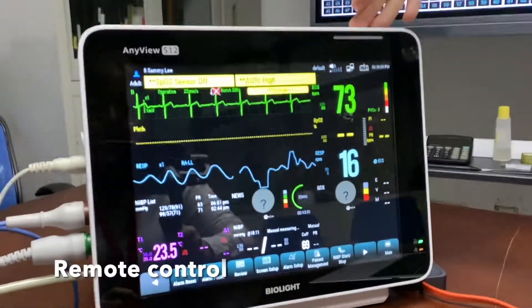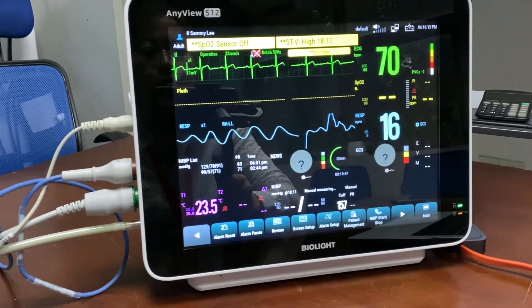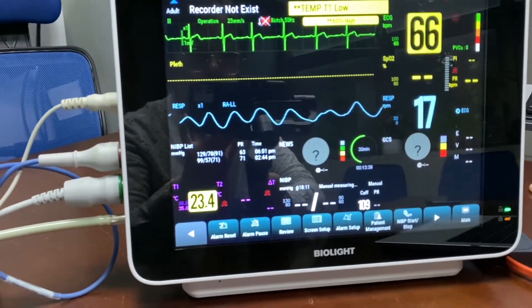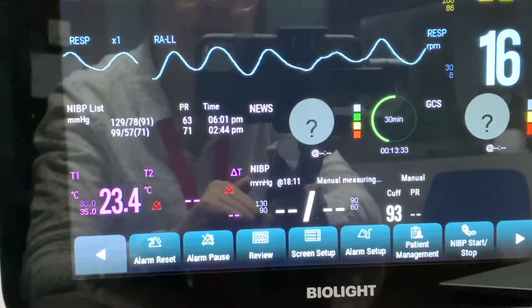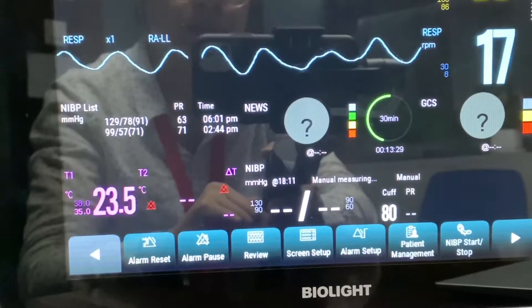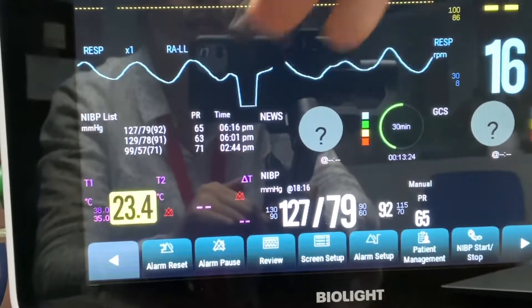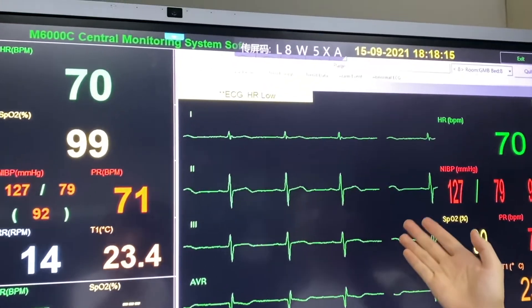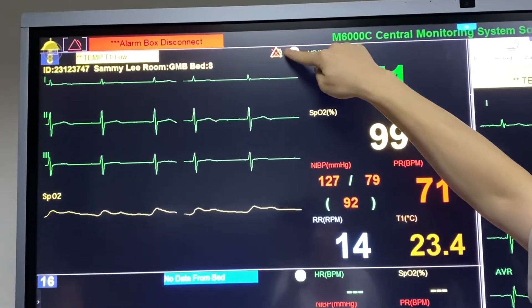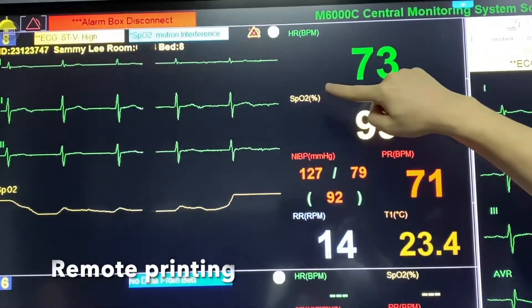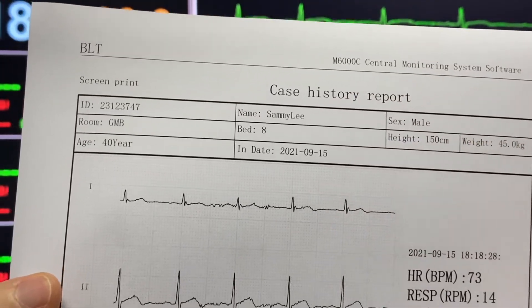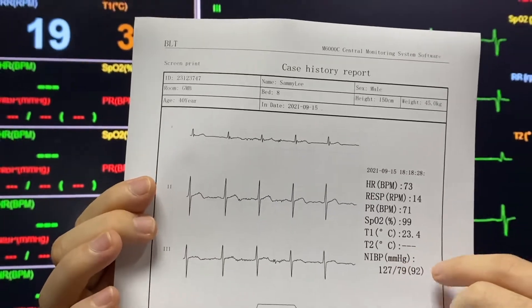Once I press the button, the machine will automatically check the patient's blood pressure remotely, which is 127 over 79. We will also get the reading in the CMS. We can also remotely print the patient's vital sign reports. If I want to print the patient's results, I can click onto the arrow and click print — if a printer is connected to the central monitor. The printed report is a case history report showing patient waveforms including ECG and SPO2, and whichever waveforms are visible on the CMS.